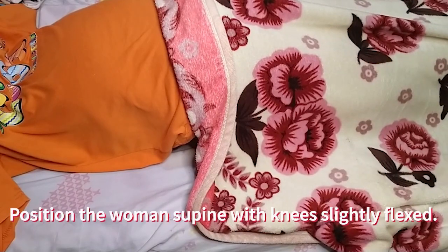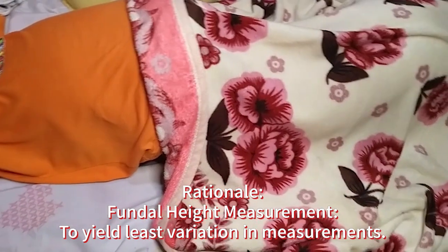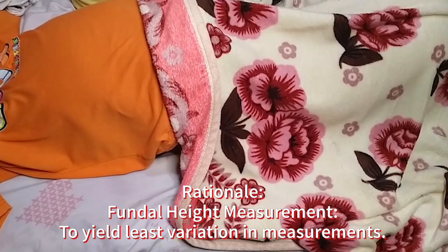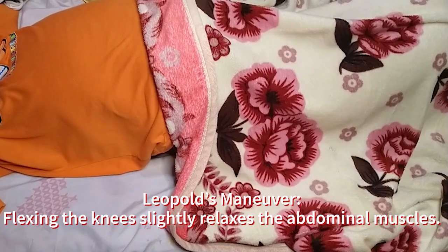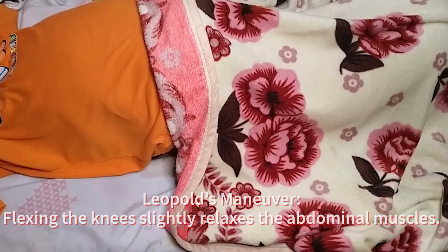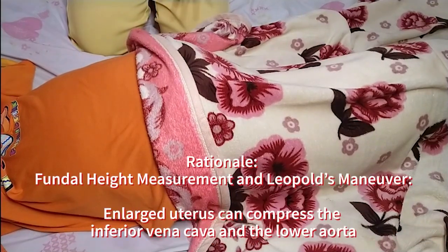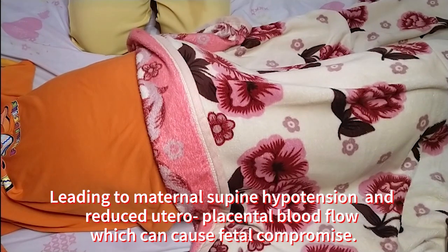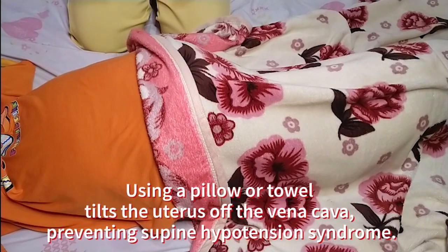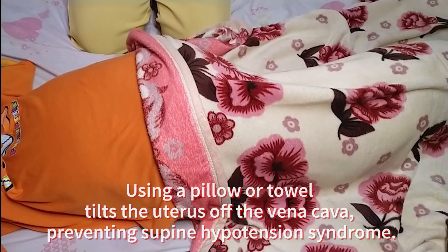Position the woman supine with her knees slightly flexed. For fundal height measurement, a supine position has been found to yield the least variation in measurements. For Leopold's maneuver, the flexing of the knees slightly relaxes the abdominal muscles. Place a small pillow or rolled towel under her left side, as an enlarged uterus can compress the inferior vena cava and the lower aorta, leading to maternal supine hypotension and reduced uteroplacental blood flow, which can cause fetal compromise. Using a pillow or towel tilts the uterus off the vena cava, preventing supine hypotension syndrome.